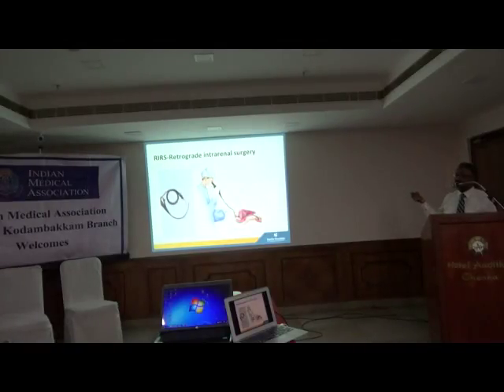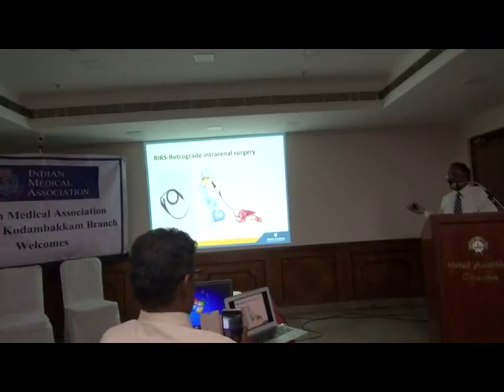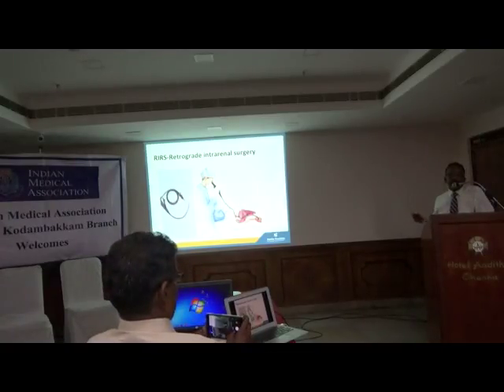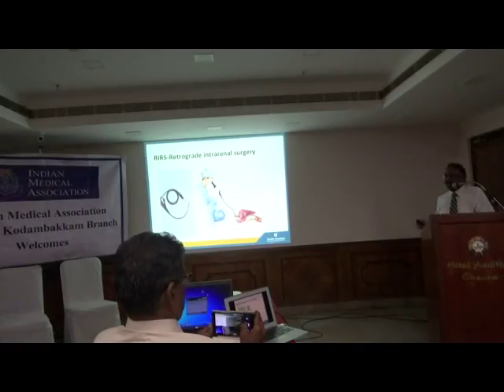The other one is RIRS. After the semi-rigid ureteroscope, this is called the flexible ureteroscope. There are a lot of changes in this. The first one is that we now have a digital scope. Earlier this was not coming in a big way because of the limitation of the scope. The scope is very fragile, and the number of cases you could use it for was much less. Now with the digital scope, the life of the scope is much longer. Again, this is complemented by the use of laser and the access sheath, where we can easily tackle up to 1 cm lower pole stones with RIRS.